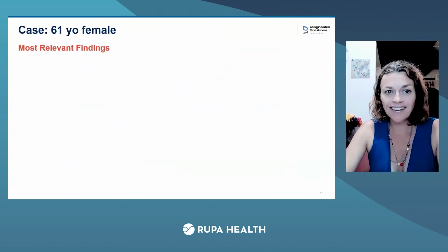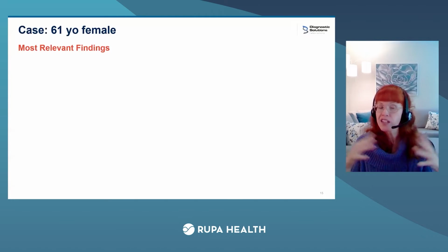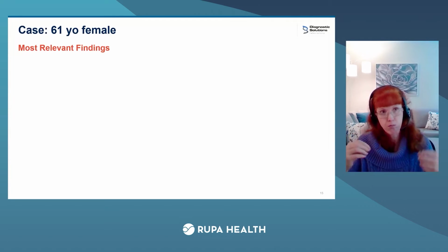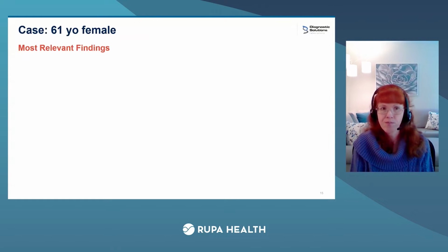All right. That was a lot. A lot going on, a complex case. But it explains why she's having these symptoms. We can go back and just connect everything. Brain fog, probably the yeast. Silent reflux, gas, belching, probably H. pylori. So we hope if we address all these things, she's going to be feeling so much better.